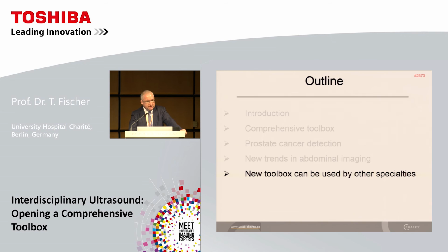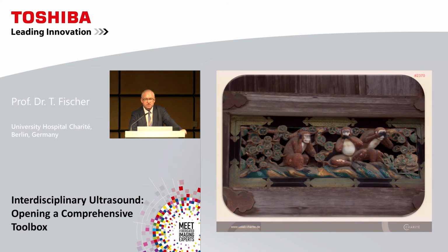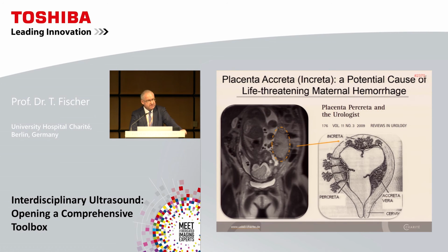This new toolbox is really important in your daily routine, but can we use this also for other specialties? Sometimes it's really difficult to discuss this problem with your clinical partners, and especially in my special situation, because my wife is a gynecologist. It's not always easy to discuss these new technologies. So it's starting this interesting approach where we have a so-called placenta accreta or increta, which is a potential cause of life-threatening maternal hemorrhage, and it's really important to make a decision.